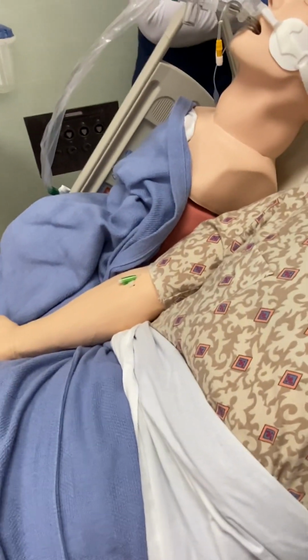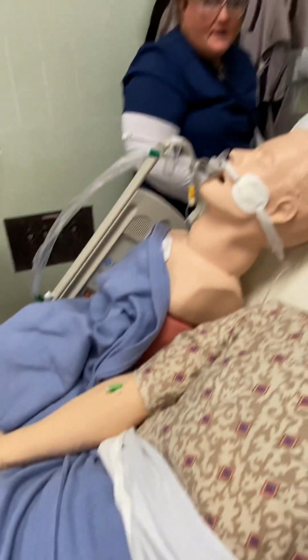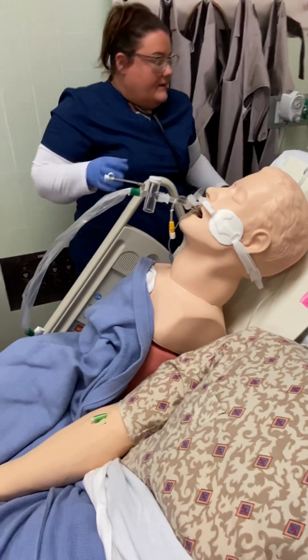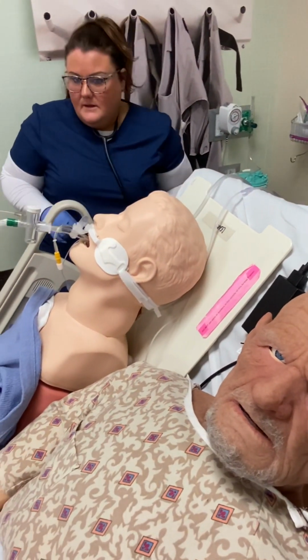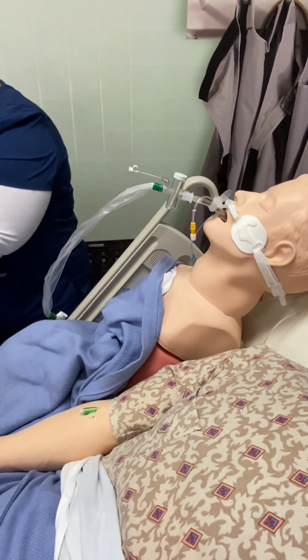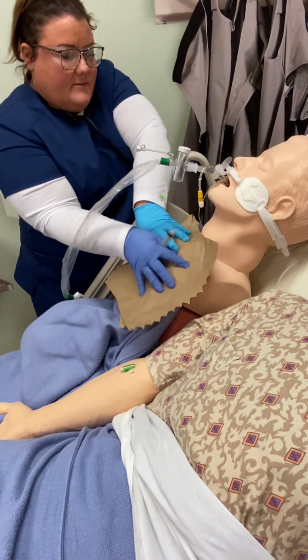Make sure that I have my bag-valve-mask readily available on standby. Okay, so I place this at the head of the bed. All right. Suction's all good. Okay. All right. So I'm gonna go ahead and get some of these napkins, more cloths. All right, we're gonna place this here.